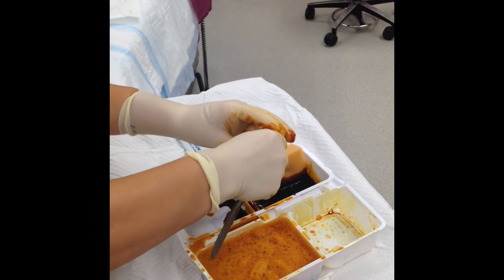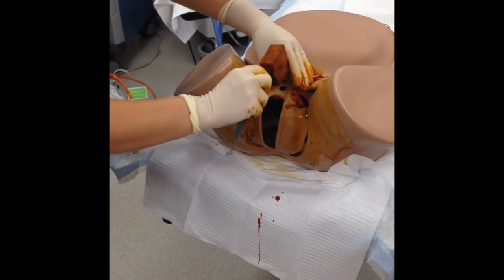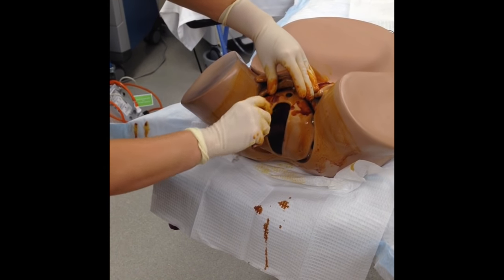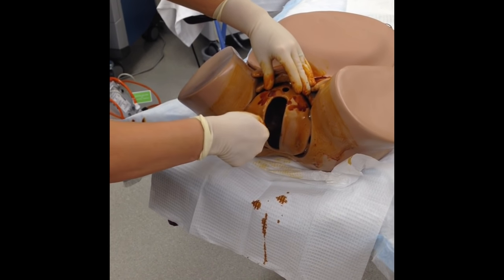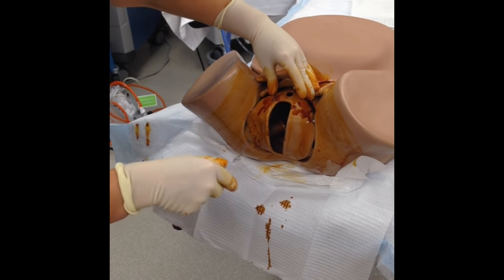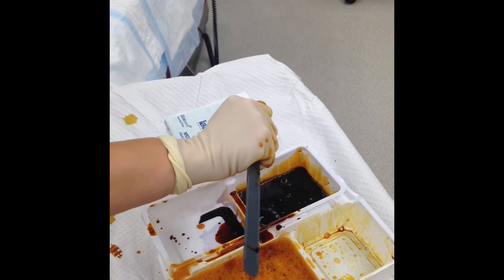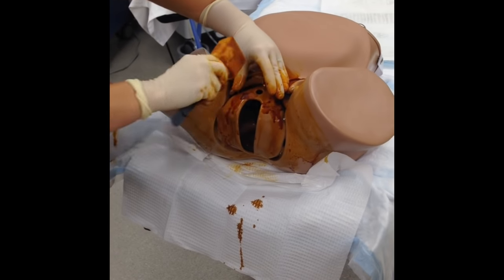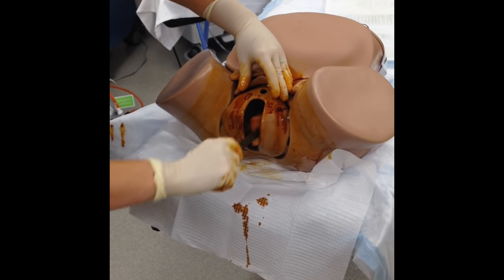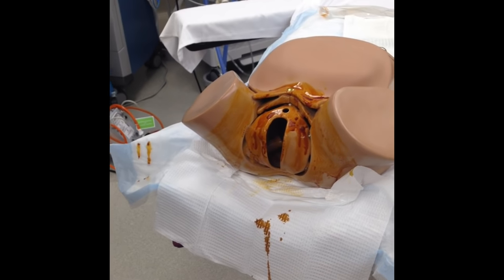Now comes the internal prep. When you're separating the vulva, make sure that you can actually see the urethral orifice, because usually there's going to be a catheterization involved. Then we're going to go gently inside and rotate to cleanse the cervix and the vagina. Swipe out towards the anus and discard. For the final one, make sure it is well wrung out. Do the same thing again, separating the vulva, getting the urethra, then gently scrub down and out through the anus and discard.